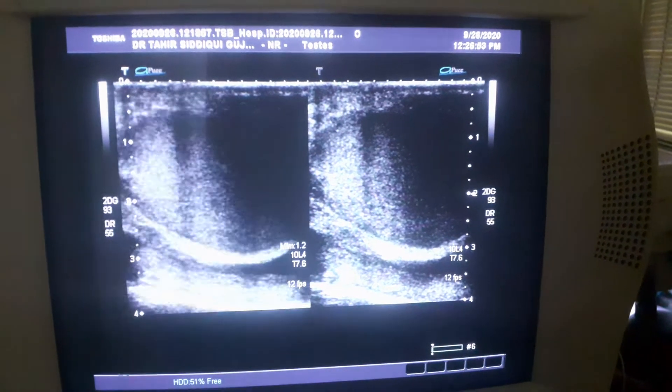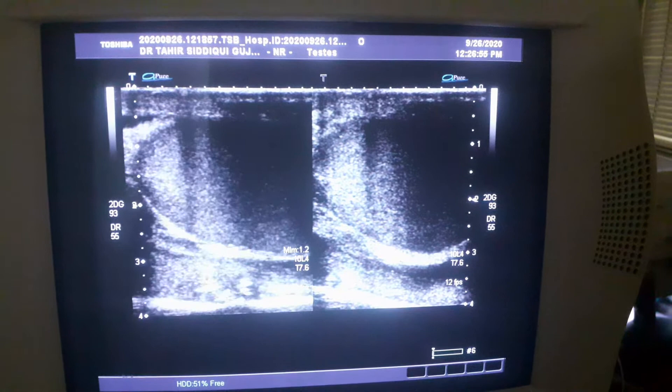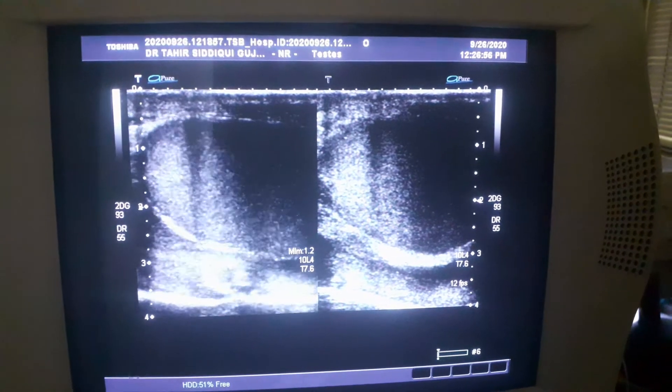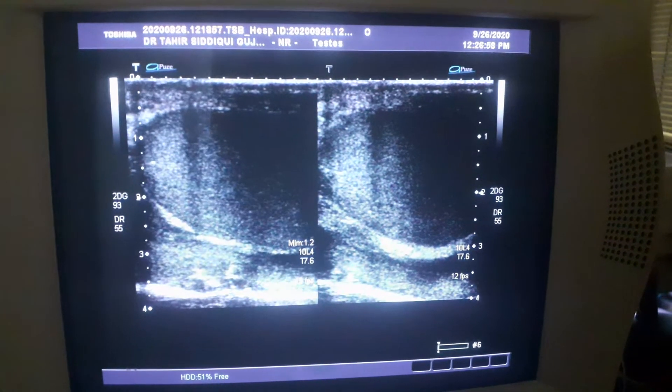This is the left hemiscrotum, showing normal testes.